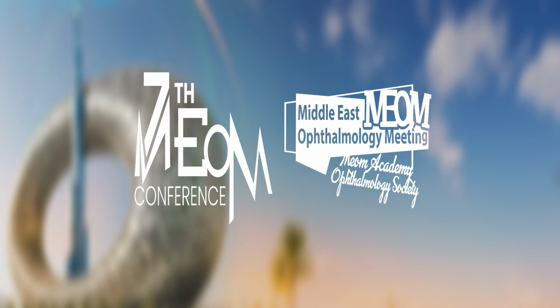So I omit the OCT angiography in that case and go for the B-scan, because the main technology of OCTA is the flow of RBCs in the vessels. If it is stagnant and low flow, it will not give the shadow effect of the abnormal vessel. So I go for the structural B-scan.